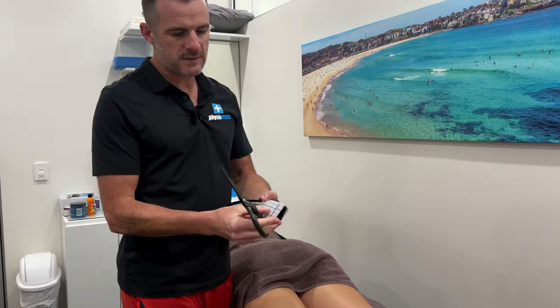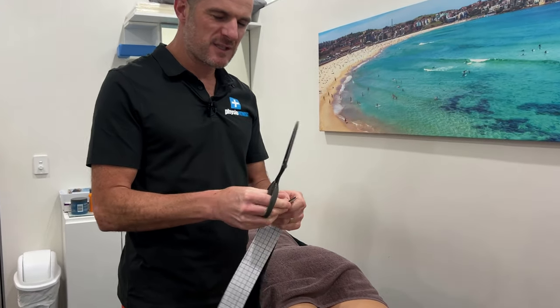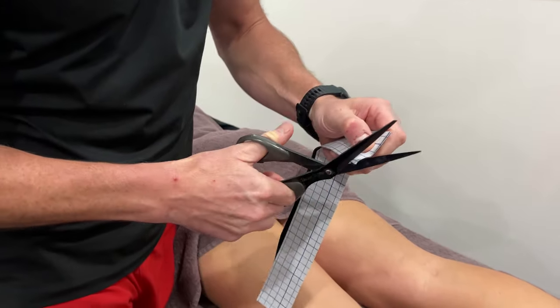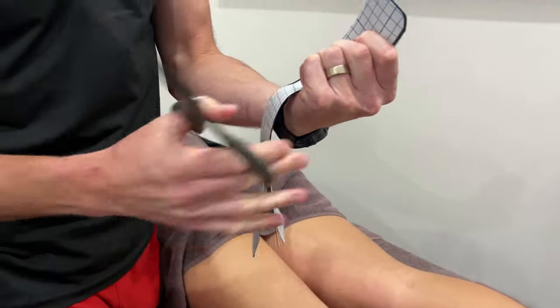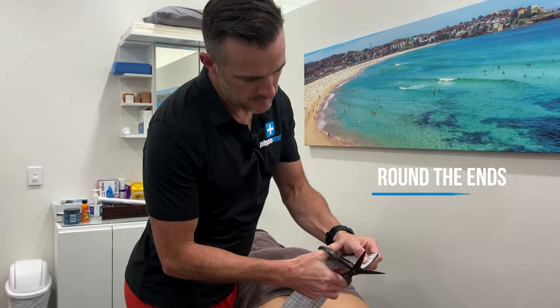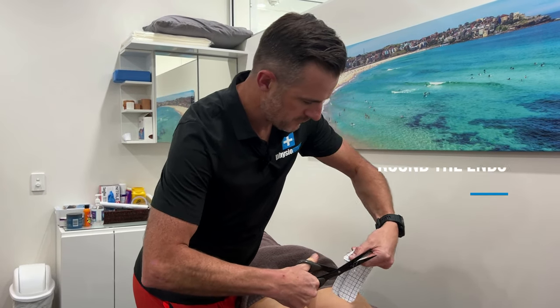Before you do anything else, cut the ends because you want them nice and rounded so they don't flick on clothing, shorts, or socks. Grab all three together and cut around like that on both ends — measure them all up together. Easy. Cut the corner off; I usually go around in one sort of scoop like that.